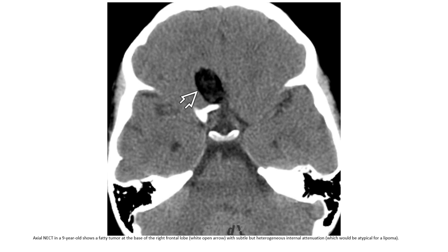Non-contrast enhanced CT in a nine-year-old showing a fatty lesion at the base of the right frontal region with subtle but heterogeneous internal attenuation, which would be atypical for a simple lipoma.